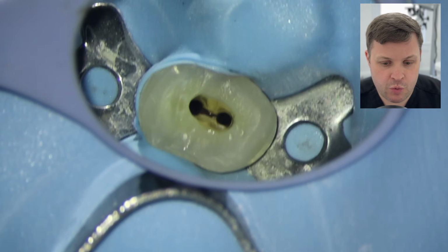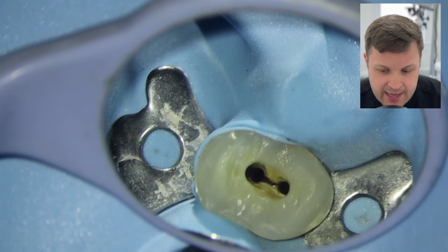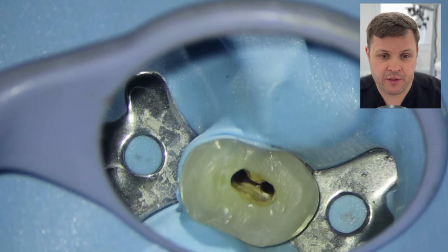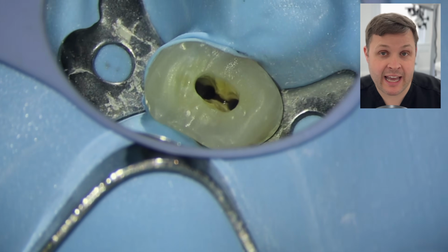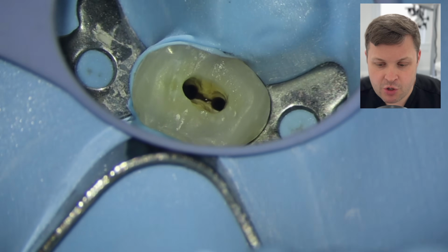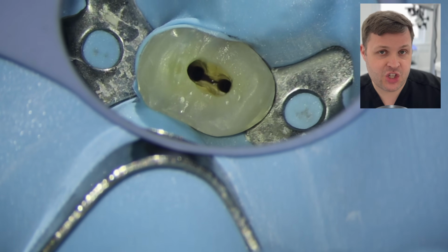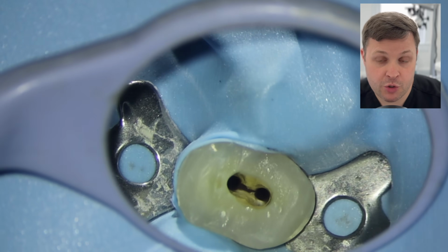We've got 2 obvious canal spaces here, and I suppose in a way, when we were irrigating and aspirating our irrigant, I noticed that both the canals weren't irrigating and aspirating together. So what I'm going to try to do now is assume that there are 2 separate canals, and we're going to do our cone fit radiograph.